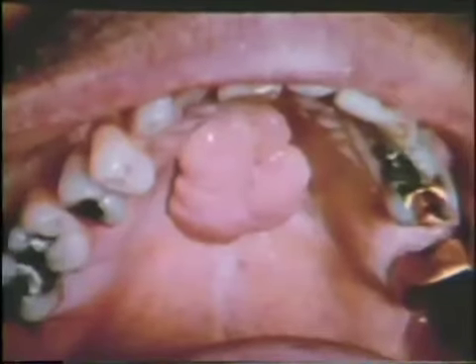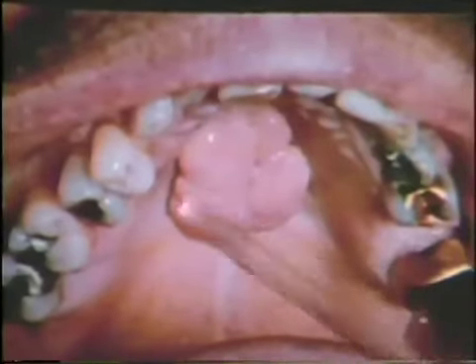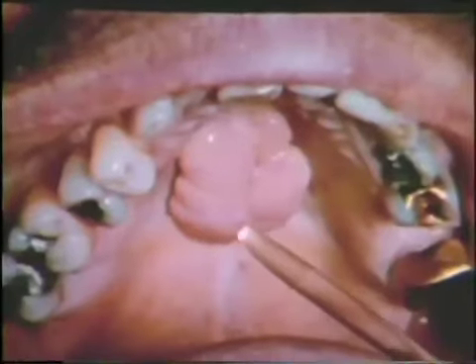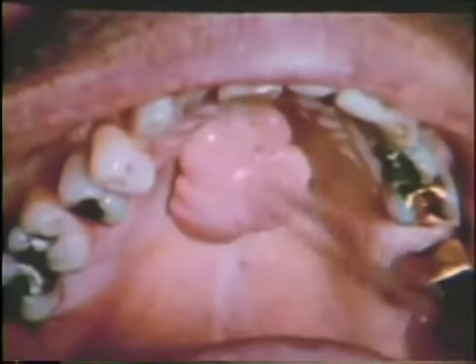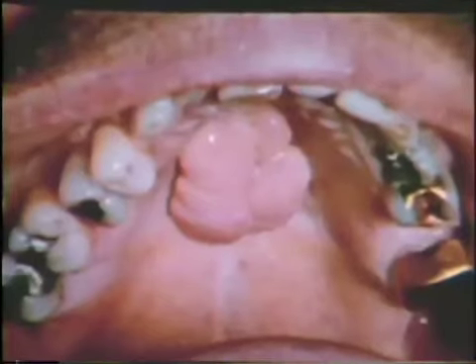In another patient, a hard mass of the palate is noted. This is a torus palatinus, a benign bony growth that may also interfere with proper film positioning. The film would have to be placed on one side or the other when radiographing the patient's teeth. Also note that the patient is lacking the maxillary left first molar and both third molars.